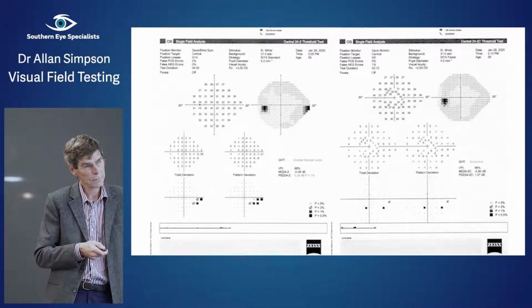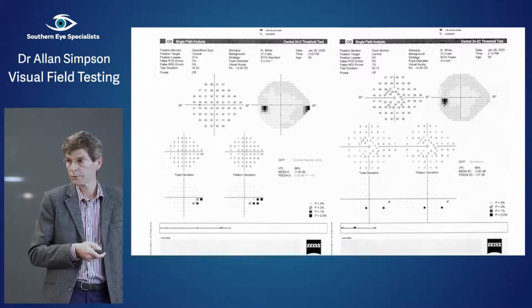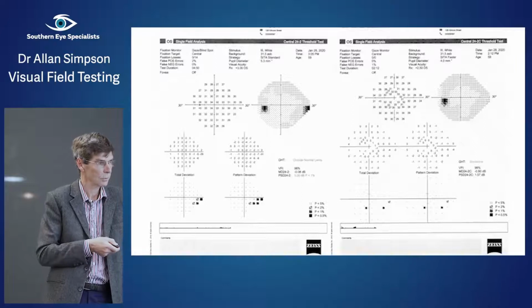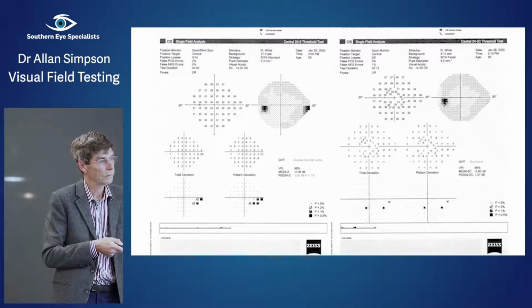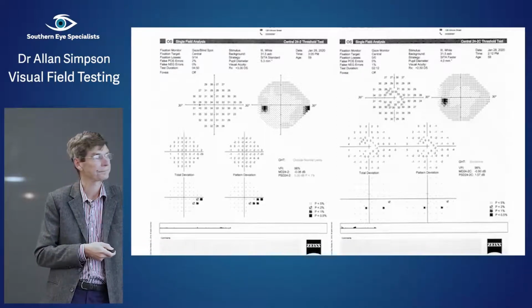So here's the test that came to me first. And it looks pretty good. There's not really much you'd pick up there as glaucomatous. But here's the one that I had been watching in the past, the field that I'd seen before, maybe a series of them, or at least this one here. On the older machine, that alerted me to the fact that I wanted to do this again on the longer test, and this looks to me like a reasonably significant inferior nasal step. Do you agree?